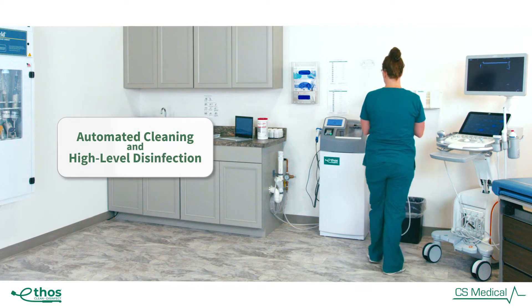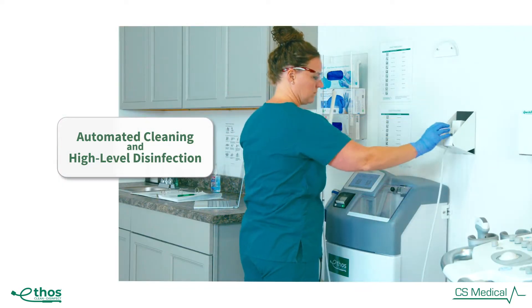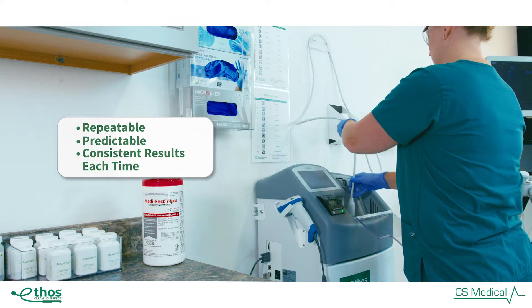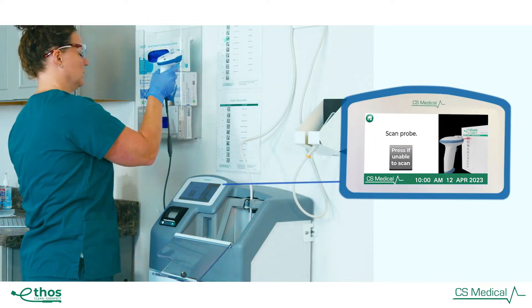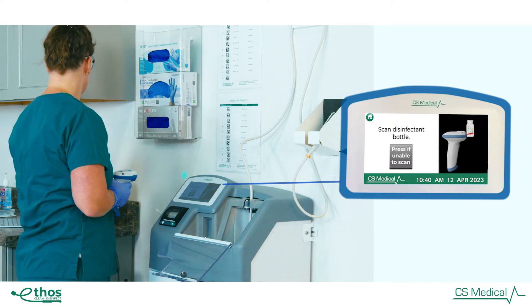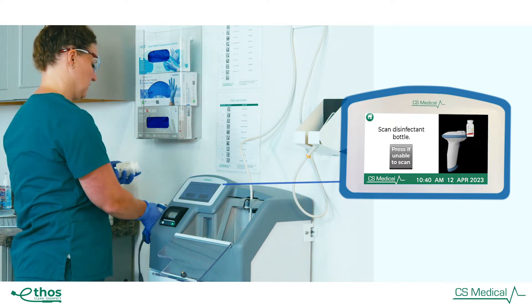Ethos is designed to automate the manual cleaning and high-level disinfection of surface and endocavity ultrasound probes — repeatable, predictable, and consistent. Ethos gives you the same result each time: a fully cleaned and high-level disinfected ultrasound probe. Automation is the key to successful reprocessing of any ultrasound probe, and Ethos provides dependability and confidence every time.